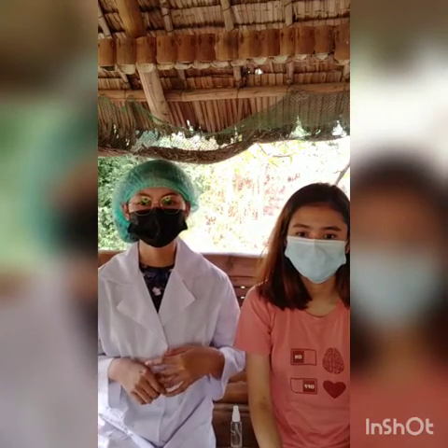And then also PPE if it is indicated. So for the procedure assessment, assess for the brachial pulse or the pulse appropriate for the site being used. Check for an intravenous line or breast or axilla surgery on the side of the body of the patient, corresponding to the arm used. Also check for the presence of a cast, arteriovenous shunt, or an injured or diseased limb.